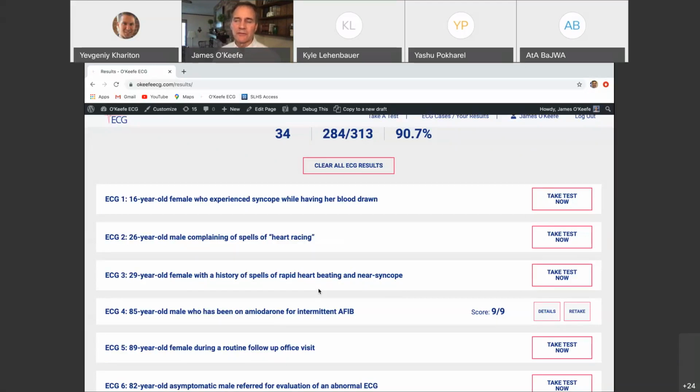If you're seeing a high grade AV block, say a complete heart block, and the rate is 35 and the QRS is only 130 milliseconds, you'd still think it's probably more like an idioventricular rhythm, because escape junctional rhythms are usually 40 to 60, and accelerated junctional rhythm is above 60. Escape ventricular rhythms are more like anywhere from 20 to 50, but typically 30 or 40.